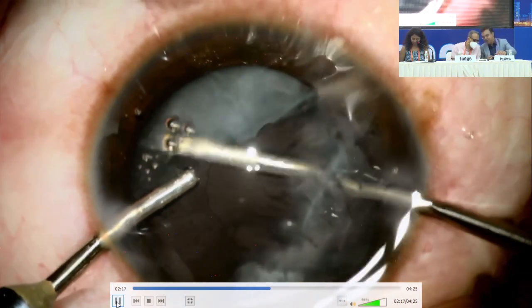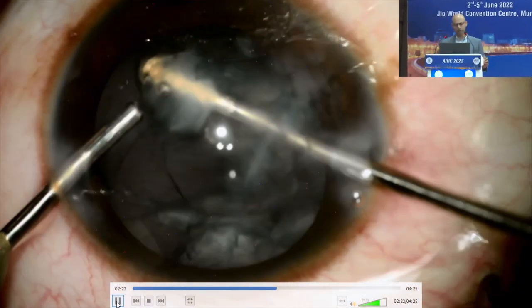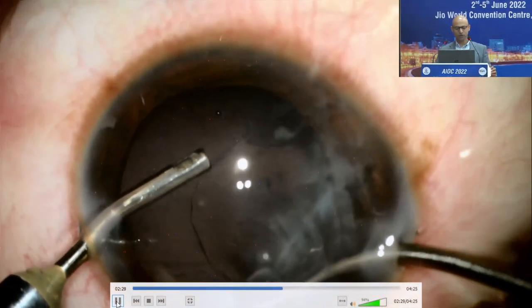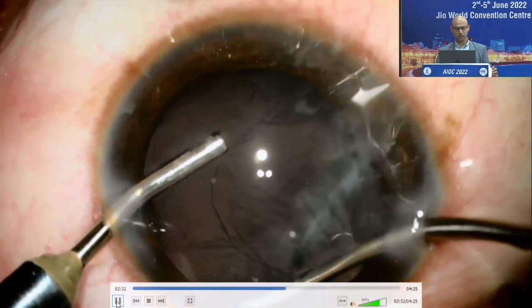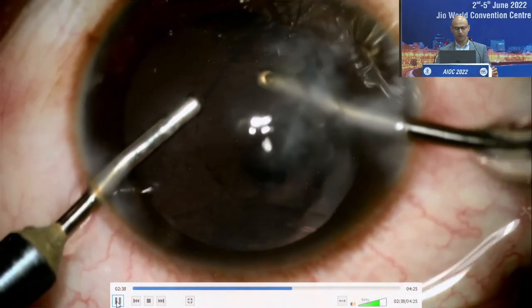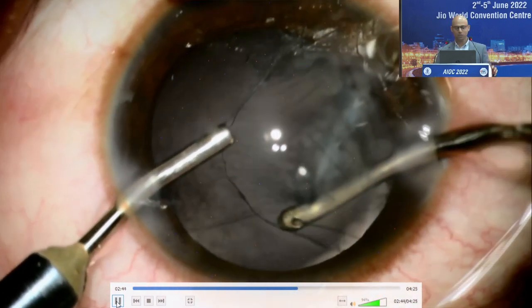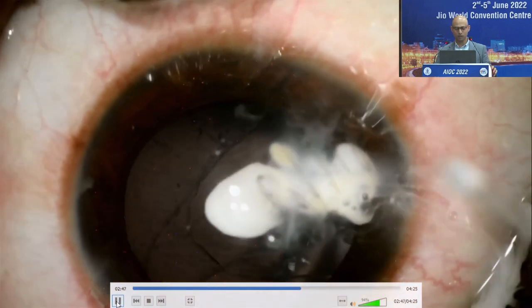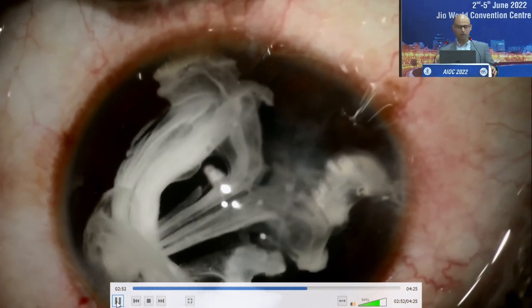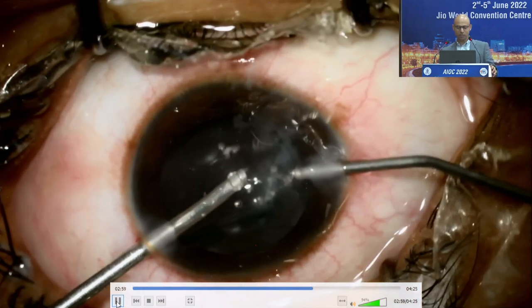Now basically I'm doing a bimanual irrigation aspiration with a controlled aspiration so that it doesn't fall into the vitreous. Now you can see the configuration of the posterior tear, which is a large V-shaped tear extending from one edge to the other. On the right side you can see that both the anterior capsule and the posterior capsule are deficient. At this point I'm planning how I'm going to put the lens and which lens. At this stage I put the triamcinolone. I could have probably done it before the cortical aspiration also, but I was fairly sure that I didn't have vitreous at that stage. But now I can see a strand coming to the wound.